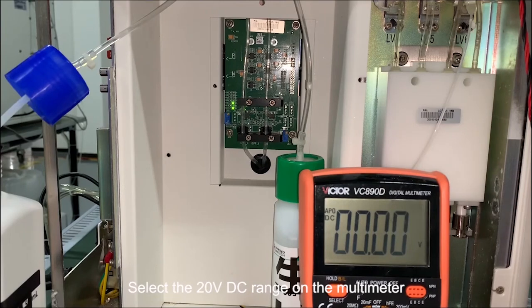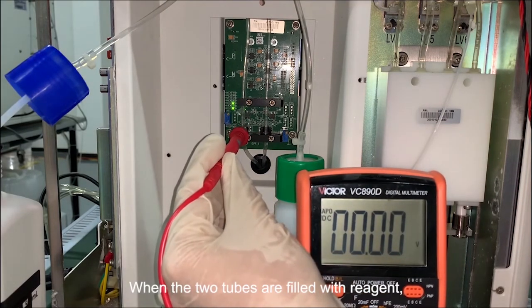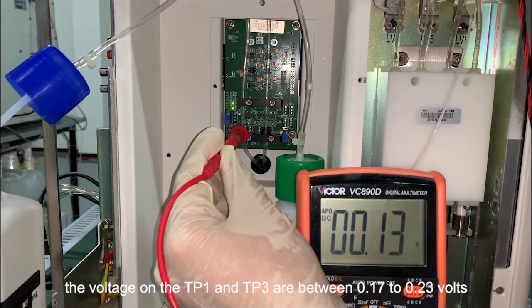Select the 20 volts DC range on the multimeter. When the two tubes are filled with reagent, the voltage on TP1 and TP3 should be between 0.17 to 0.23 volts.